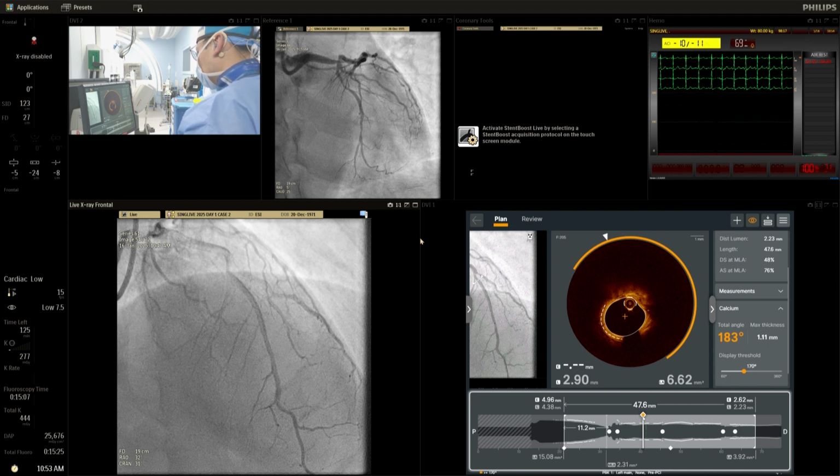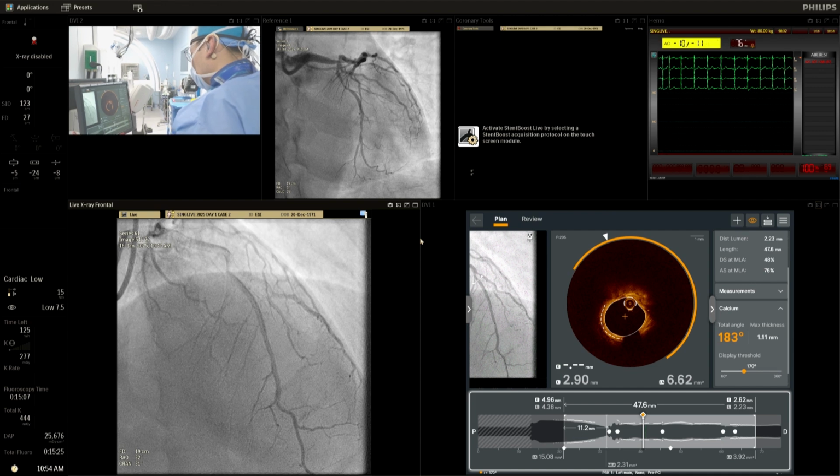I'd be interested in the panel's opinion. So we run 6 labs. Do you have OCT like this in every lab? My bias is that, given the amount of money we have to pay for this integrated system, it should deliver the stents for us. It should do everything.